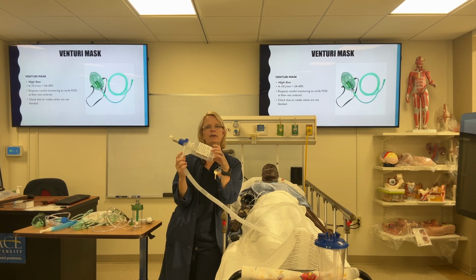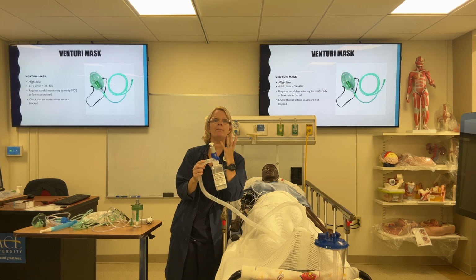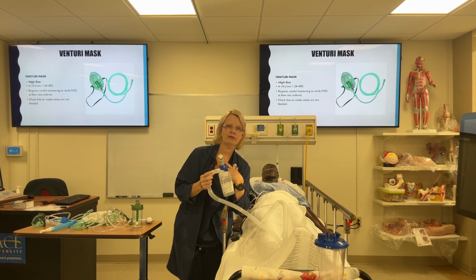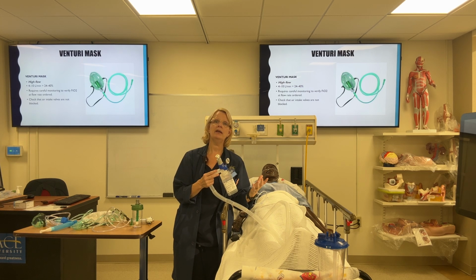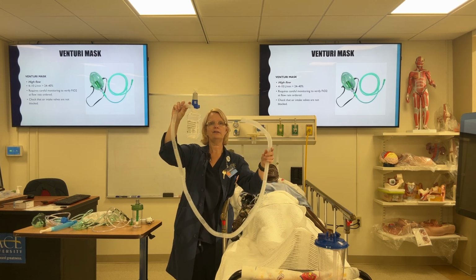It just means I'm giving the patient sterile water, under compression, that's going to make their oxygen more moist and misty, so that their mucous membranes are less dry and they are able to tolerate maybe that face mask after they've just been extubated. And so I want to set the patient to that, let's say 35% or 40% FiO2 after they're extubated. So I would get something that looks like this.